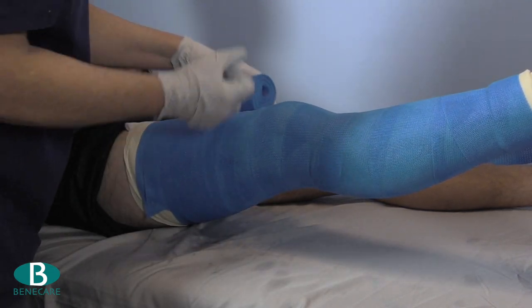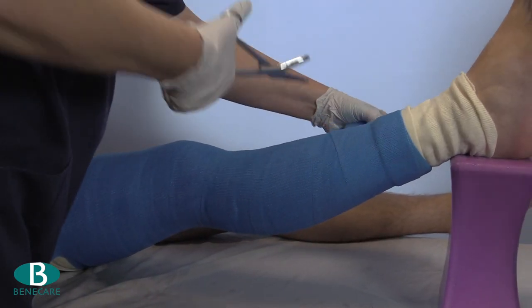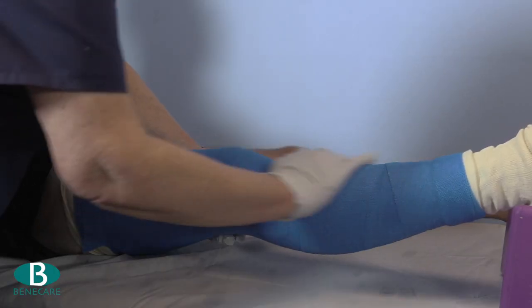Now using the second roll of Benecare Advanced, start to bandage covering edge to edge at the proximal and distal aspect of the cast, with 50% coverage over the knee for additional support.